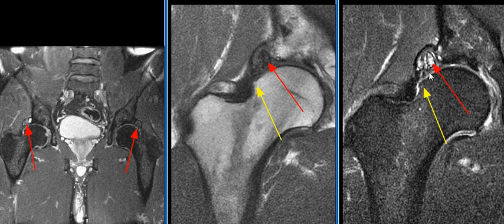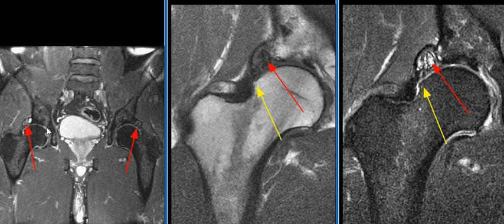The right hip shows very attenuated labral tissue along with capsular thickening and edema. Edema is also seen within the os and the acetabulum at their articulation. Cystic changes are seen in the lateral acetabular rim along with chondral degeneration in the supralateral acetabular roof.